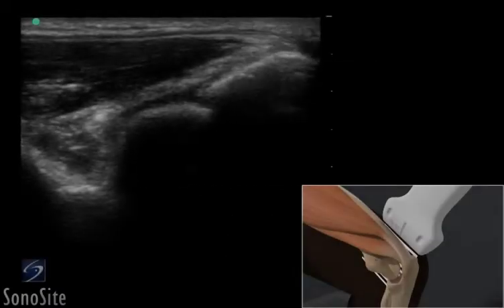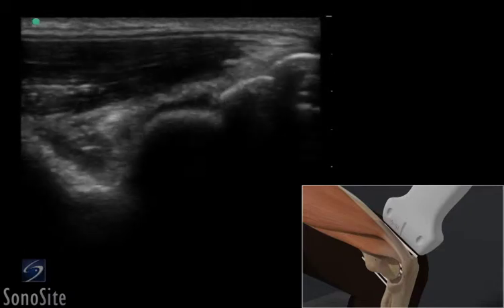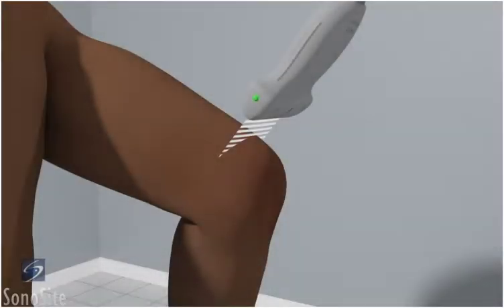A linear array transducer with a musculoskeletal exam type is used to perform an ultrasound examination of the olecranon. The patient is asked to flex their elbow 90 degrees with the hand placed on the examination table.